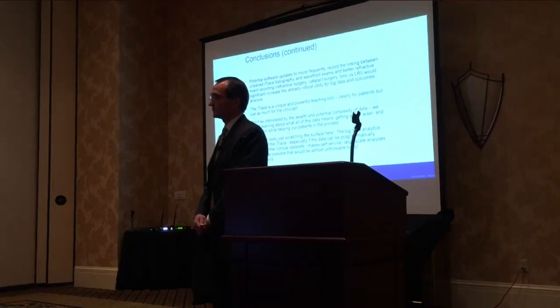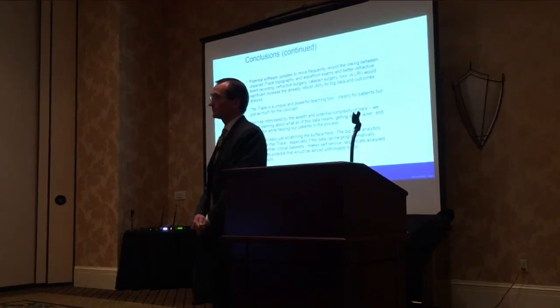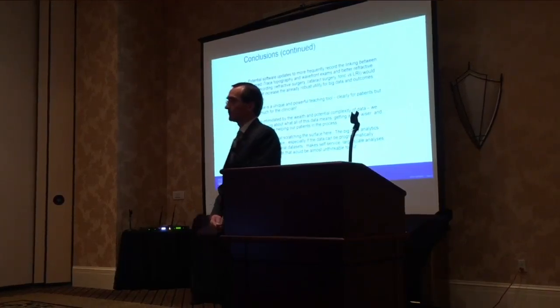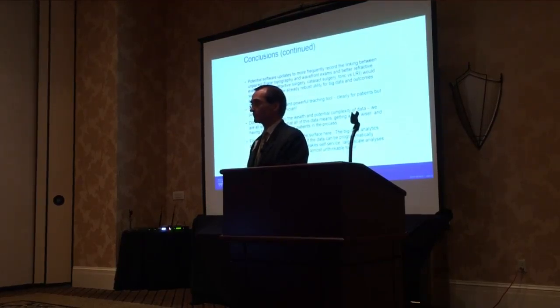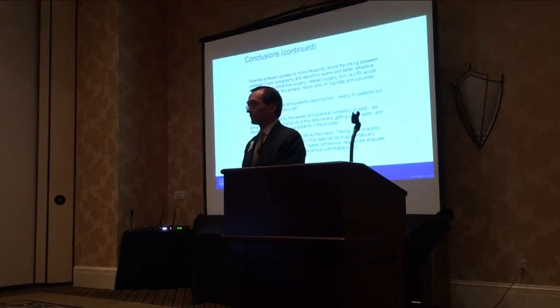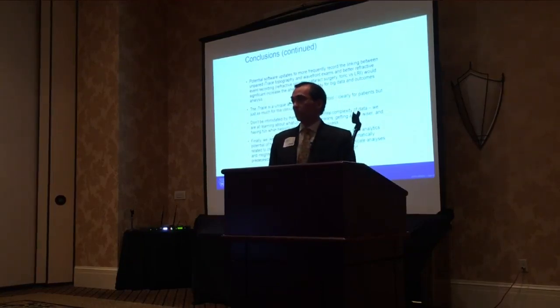Because at least we can see the multifocal center in the pupil. So is there a way with the iTrace that you can tell the center of a multifocal lens with the little rings? Because if you could do that and correlate that to the visual axis, that would maybe be a more accurate way of determining the actual multifocal centration and how it relates to the visual axis pre-op.